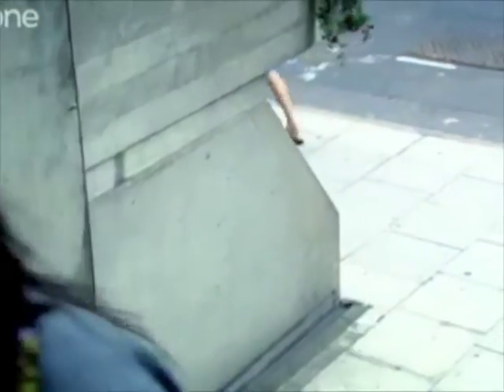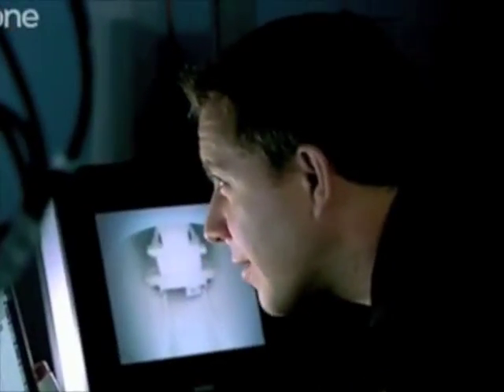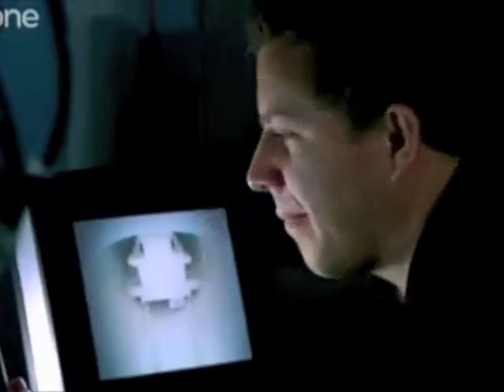I've come to meet a neuroscientist who's going to help me recreate a very clever little experiment that was first carried out by a certain Professor Oman in Sweden. The experiment is simple. I lie in an MRI scanner and they show me some pictures. All right, we're going to show you various pictures on the screen, so your job is just to lie still and watch them while the scanner measures your brain activity, okay? Okay. When the experiment begins, a series of random images are flashed before my eyes.